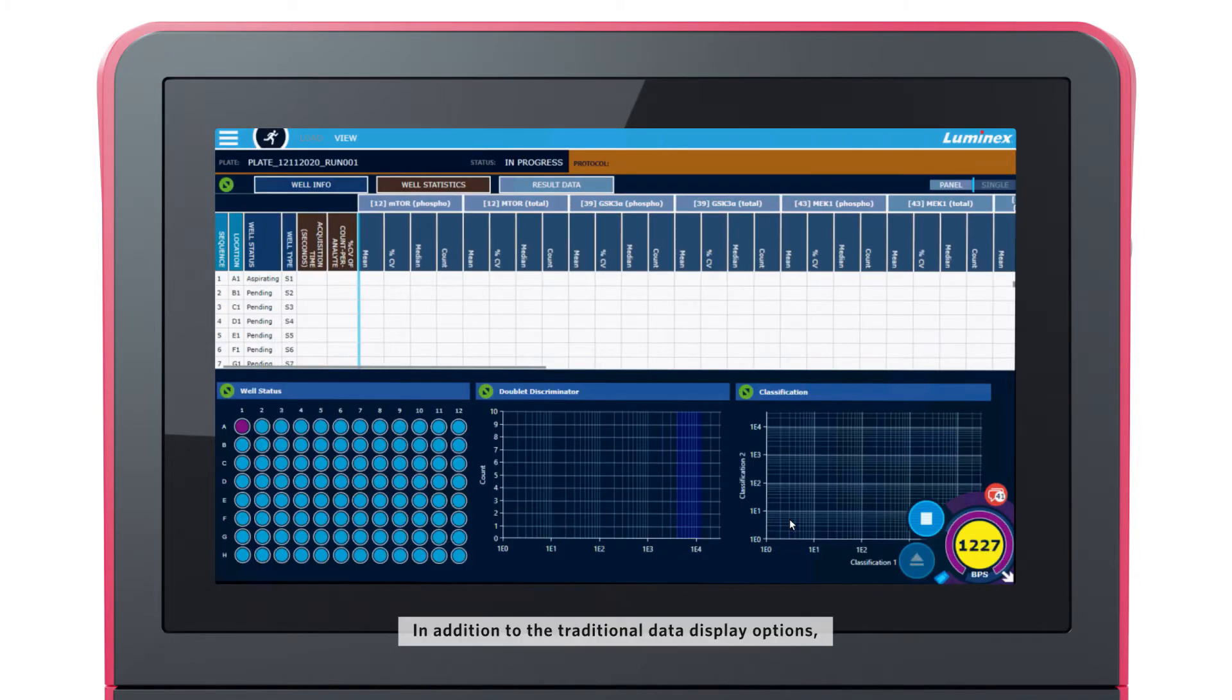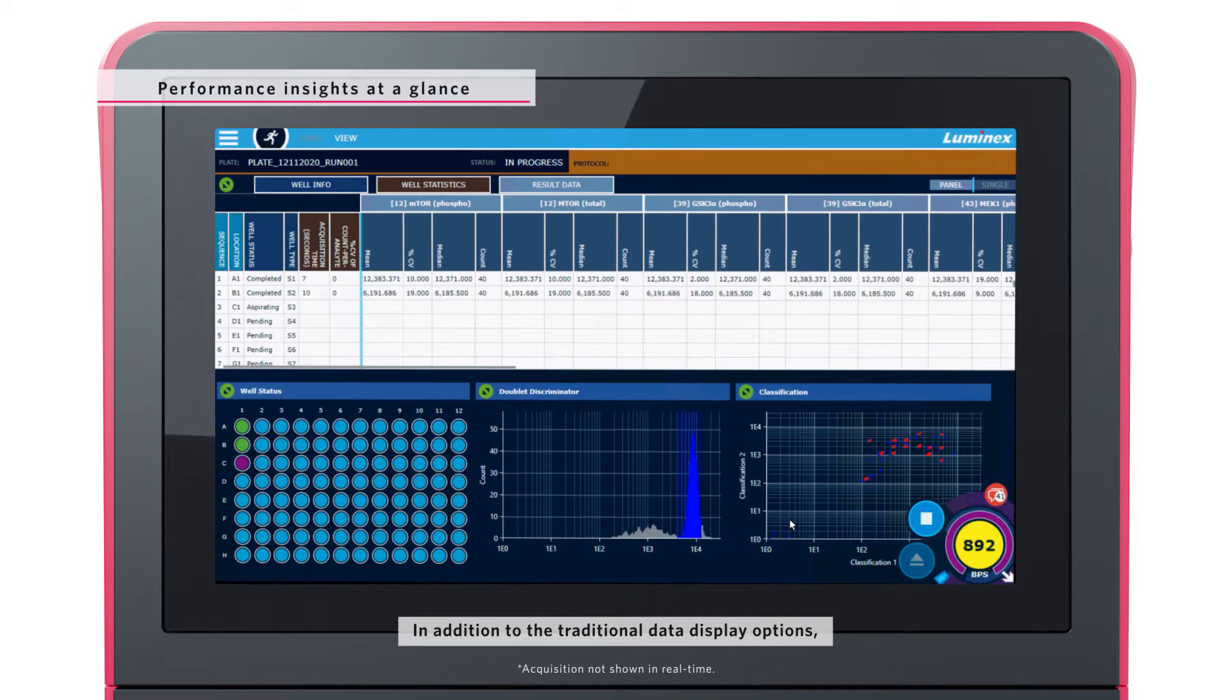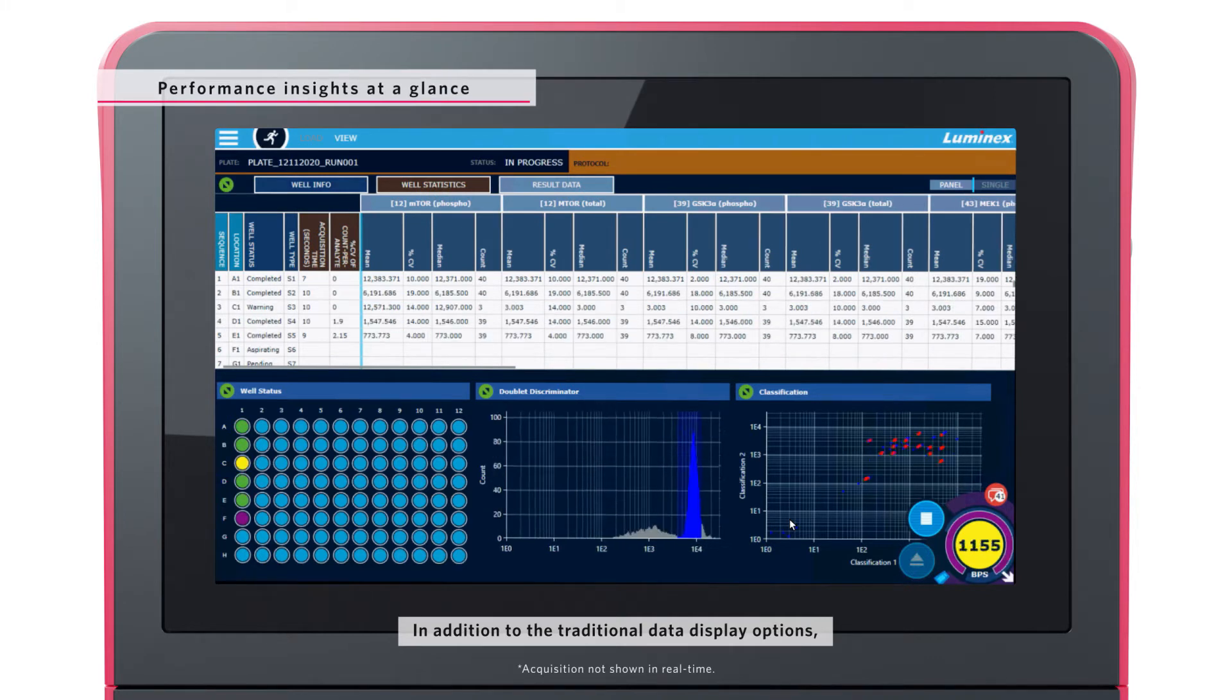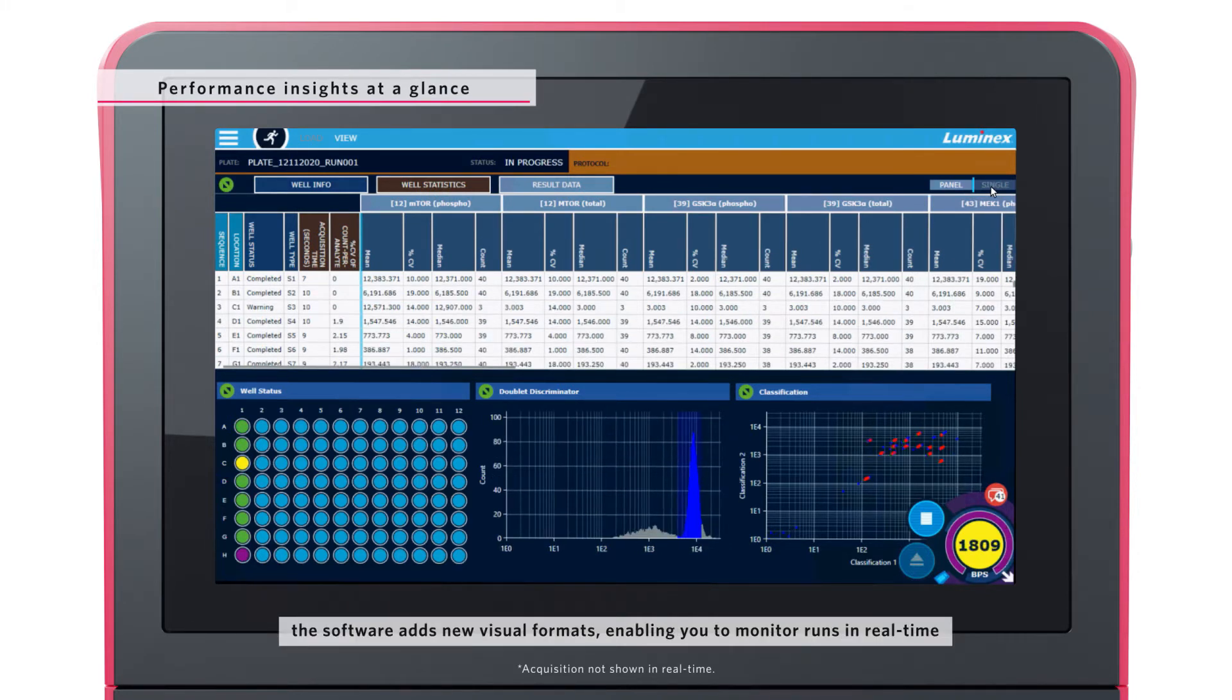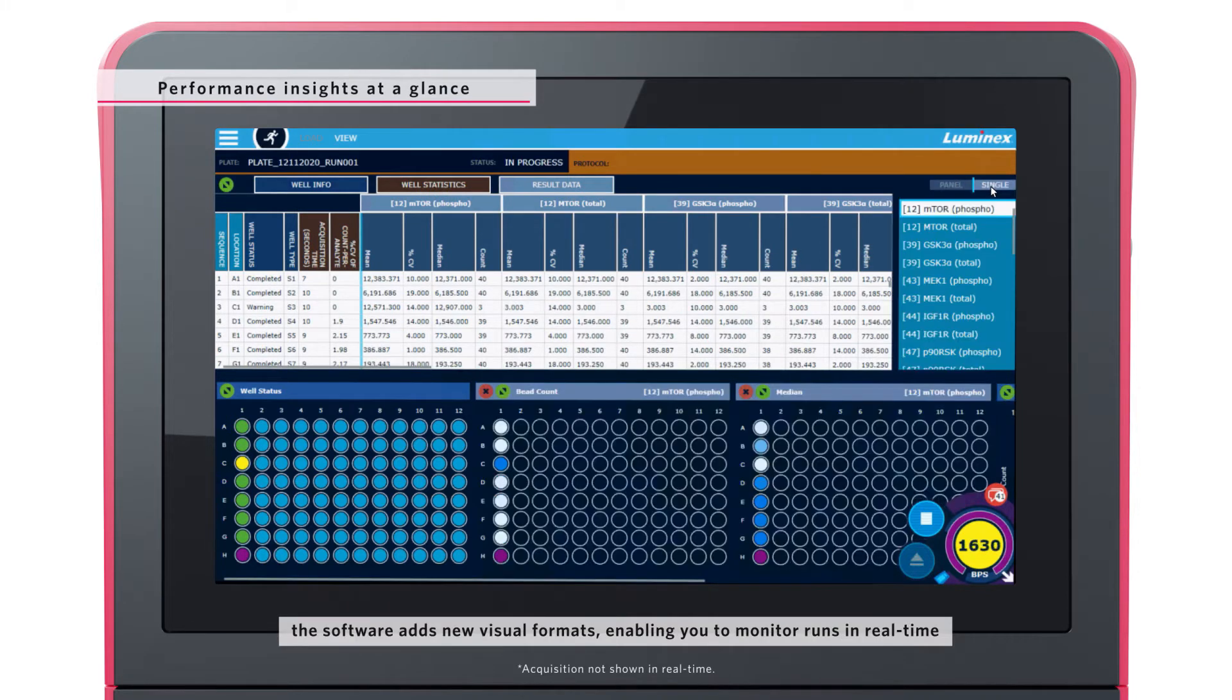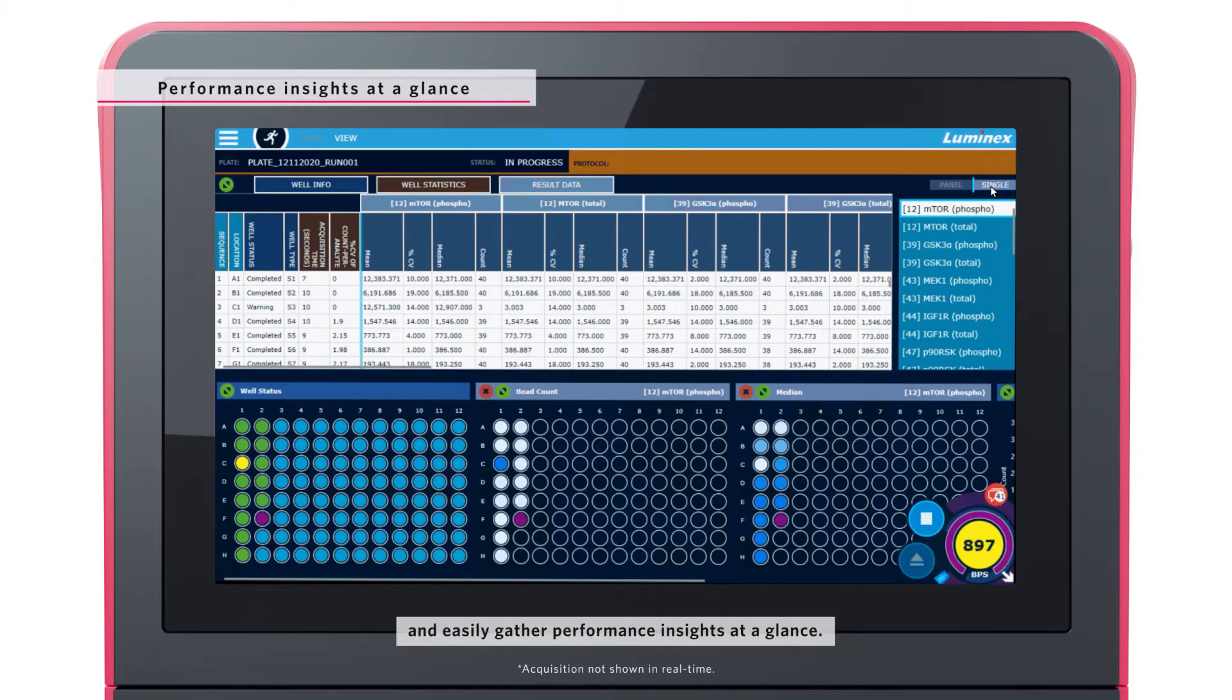In addition to the traditional data display options, the software adds new visual formats, enabling you to monitor runs in real-time and easily gather performance insights at a glance.